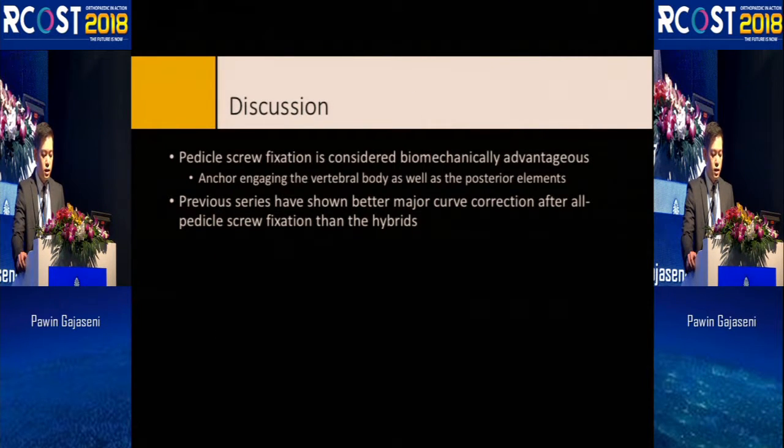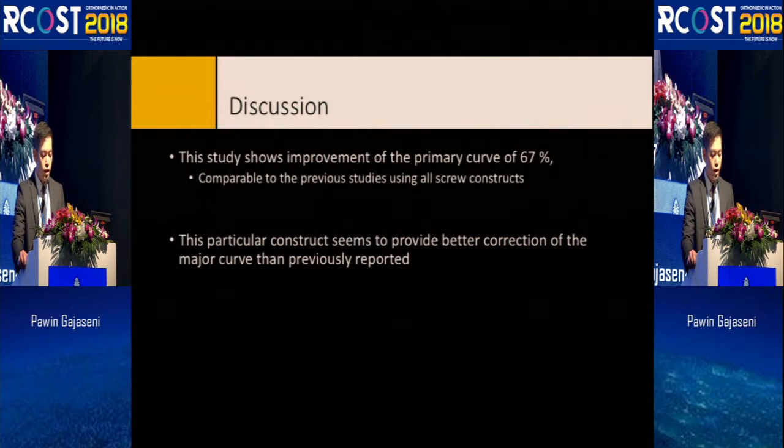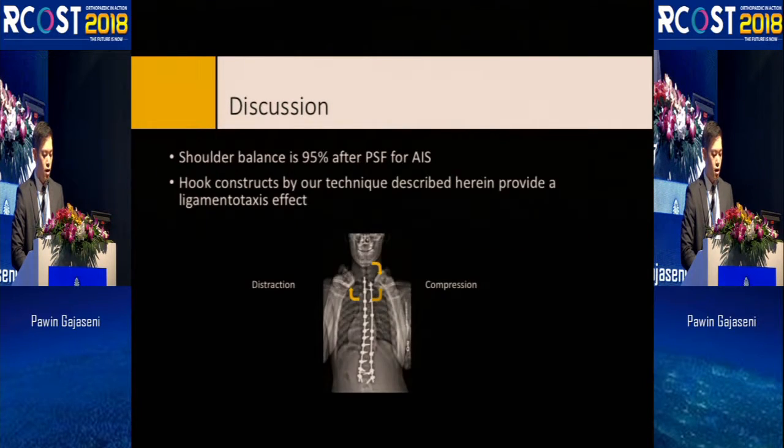Pedicle screw fixation has been considered biomechanically advantageous because it uses the pedicle as the anchor, anchoring both the vertebral body and the posterior elements. Previous series have shown better major curve correction after all-pedicle-screw fixation than the hybrid. Our results show improvement of the primary curve of around 67%, which is comparable to previous studies using all-screw constructs, and this construct seems to provide better correction of the major curve than previously reported hybrid constructs. The curve correction is comparable to the PDS, and the shoulder balance was also better than in any reported series, which report around 85 to 90%. In our series, the shoulder balance is around 95% after surgery.